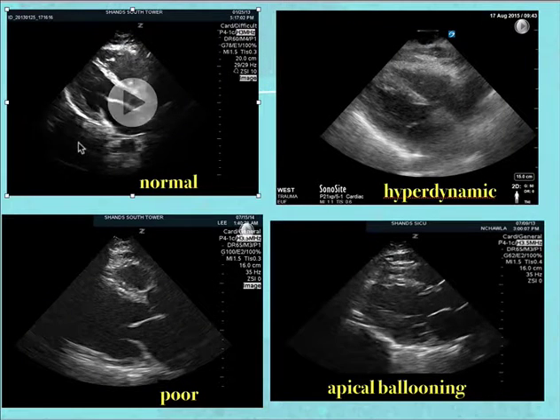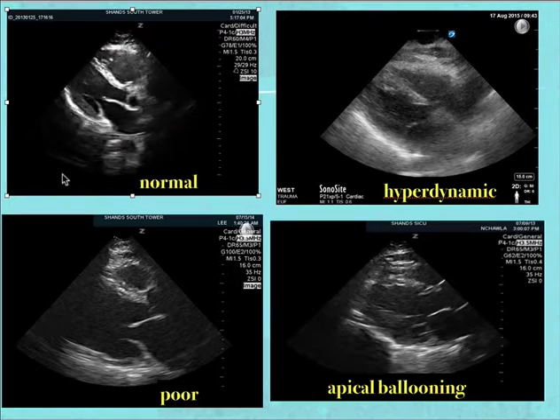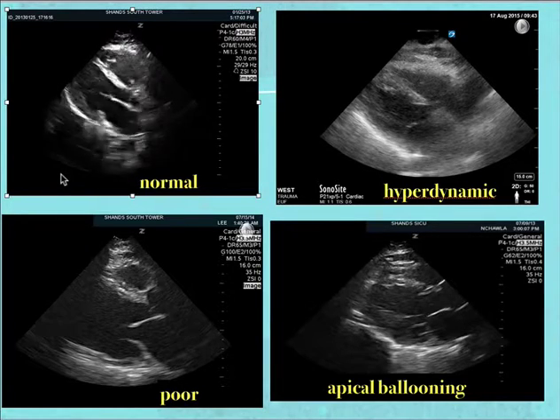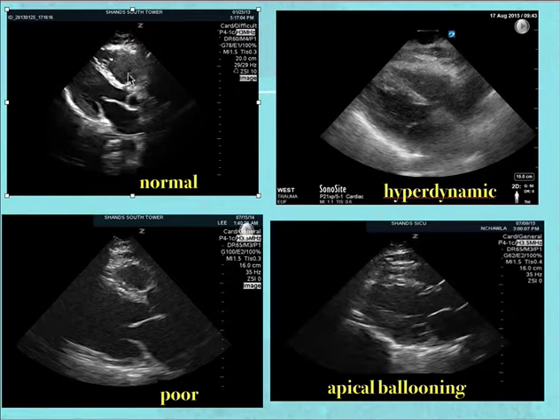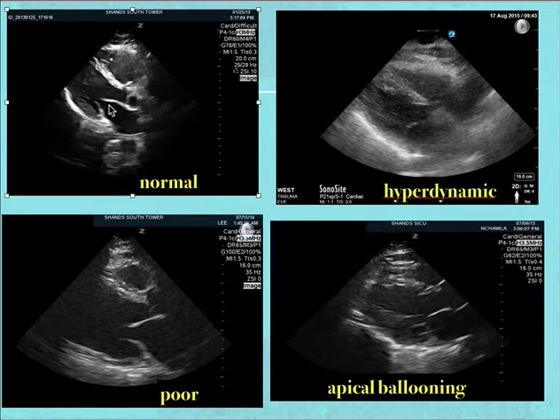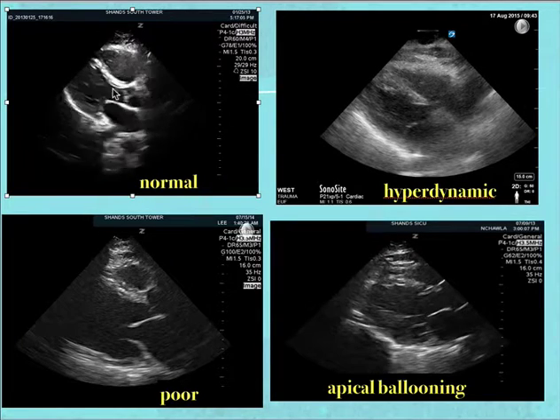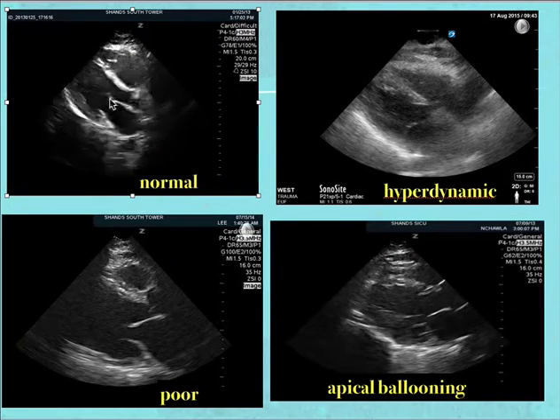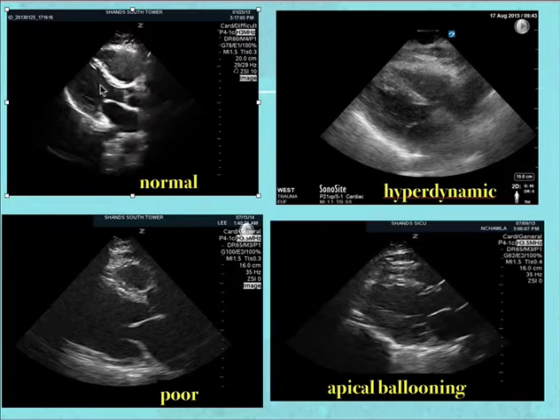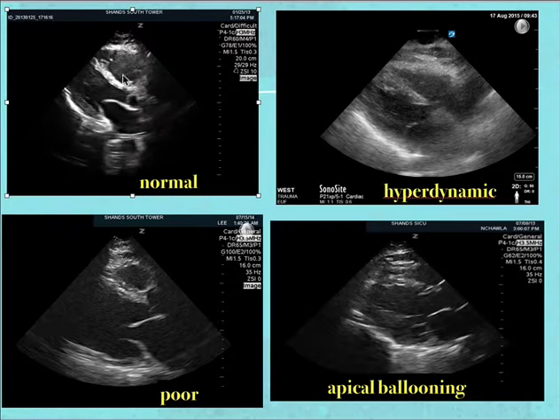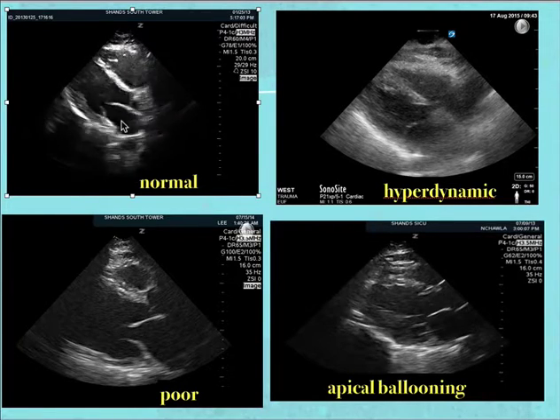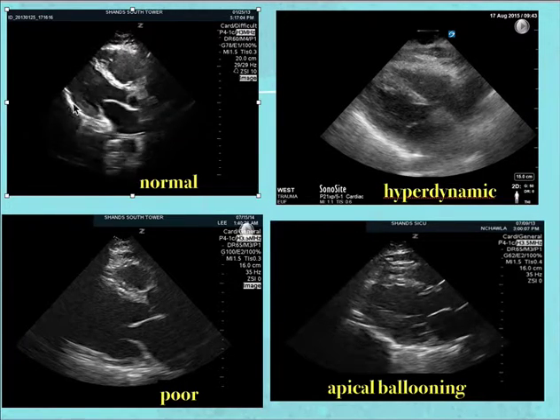Here are some images. In the top left, you see normal function in a parasternal long view. The mitral valve is hitting the LV wall, the LV has good normal volume, and you can see the right ventricle, left atrium, and pericardium.